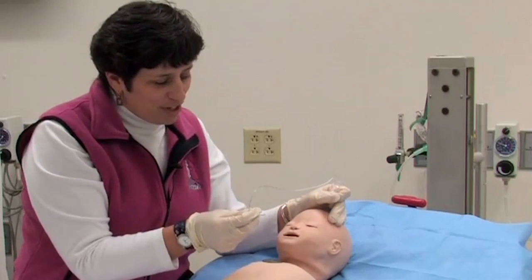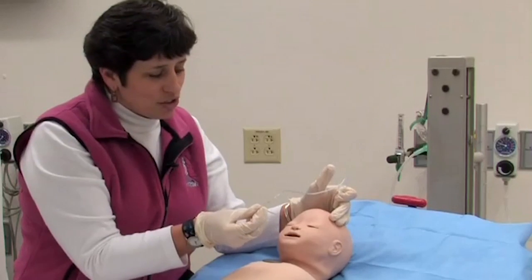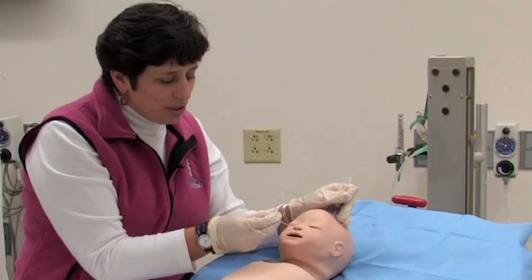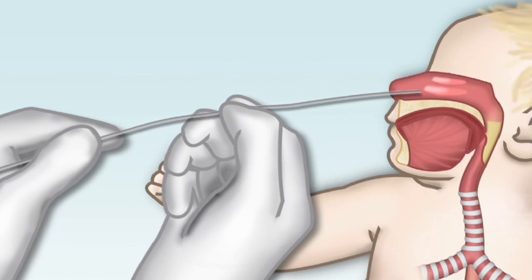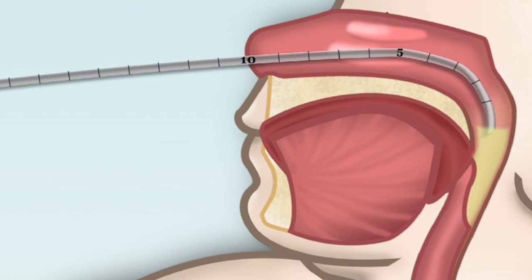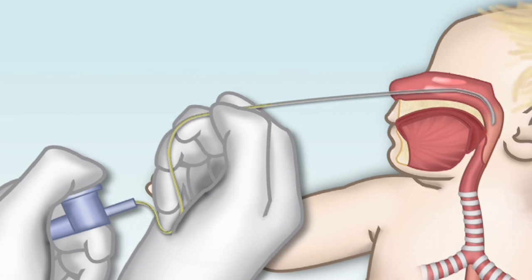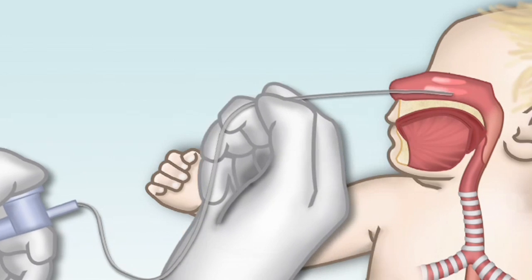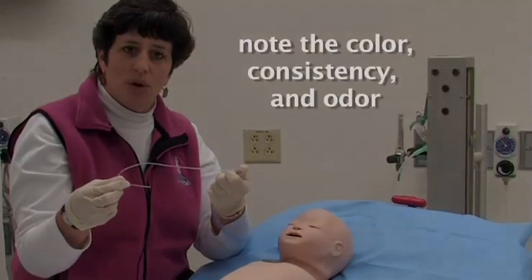I am going to gently insert the catheter without any suction applied. I will twist the catheter just a little bit to help it go down, getting to about the 10 mark. Then I am going to apply suction and continuously apply suction as I remove the catheter. As I remove the catheter, I want to note the color and consistency of the secretions and whether there is any odor.